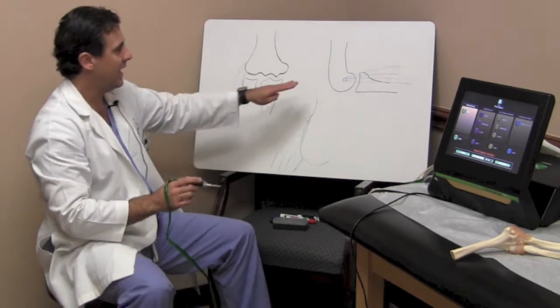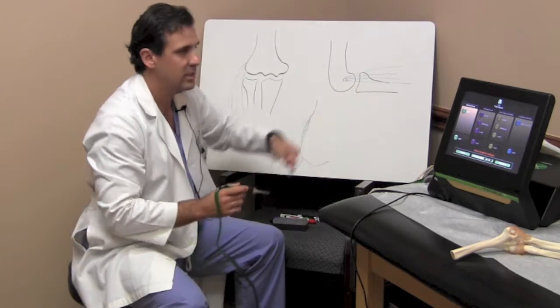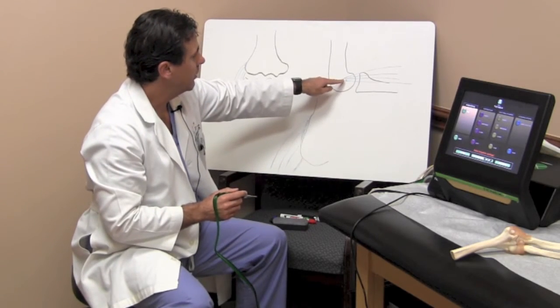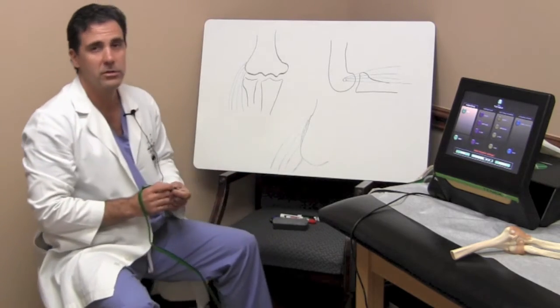And looking at it from a side view here, the radiocapitellar joint, once again, there are the common extensor tendons that are responsible for the repetitive activities of the wrist and extension. Here, we go in there and find this area and debride the area where the tendinosis is.